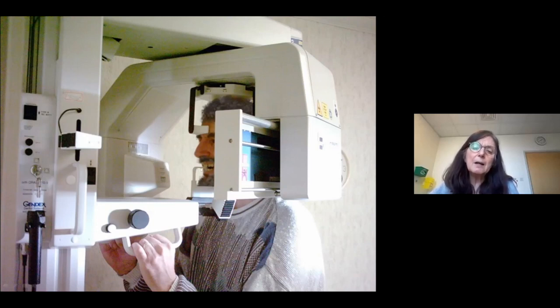They generally have a prop between their teeth to support the teeth so we can see more tooth detail. Forehead's resting here, and chin is also nestled in a little chin cap. So they're reasonably easy to position. The gantry rotates around the patient, and the acquisition time is about 20 seconds.